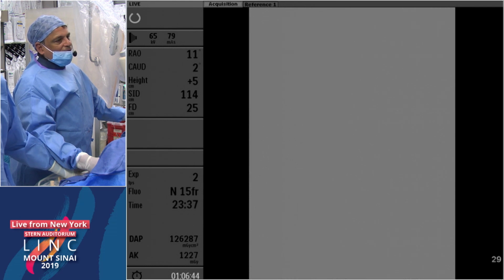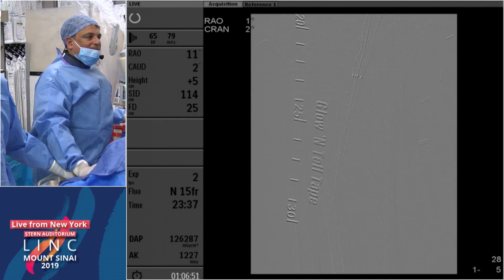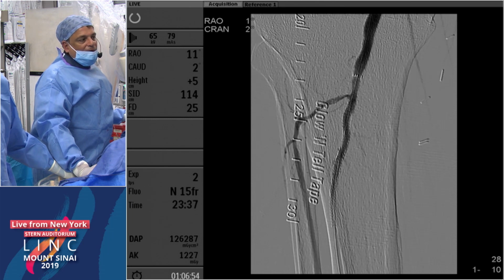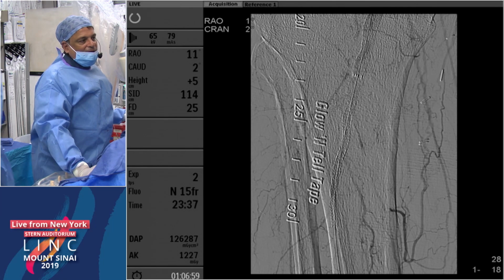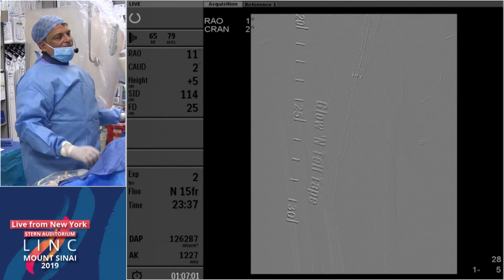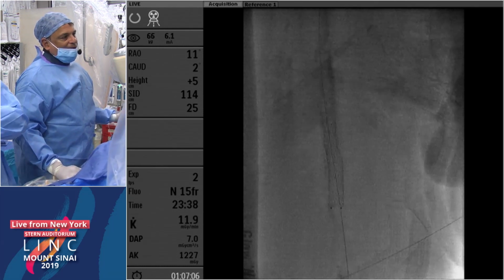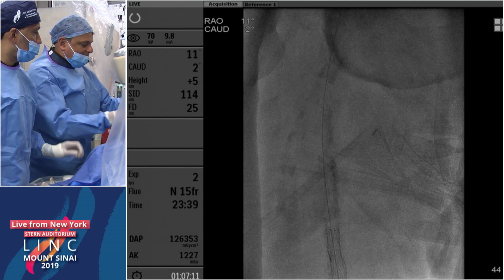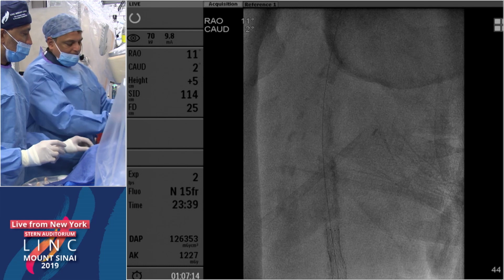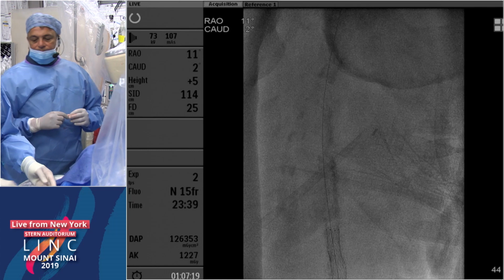So my question is, I'm just going to do a Stellarex up top and not stent anymore. I think with the drug-coated therapy, with Stellarex having the ability to work in calcium makes me feel a little more confident. So I'm just going to go ahead and do a Stellarex balloon. But are you guys okay with this? I know the covered stent was unexpected, but we would have liked to have done atherectomy and a Stellarex there. But we ended up having to use a covered stent, which I think is not so bad with this flow. No, PK, I think you got a nice result in this, and I think you bailed yourself out admirably.